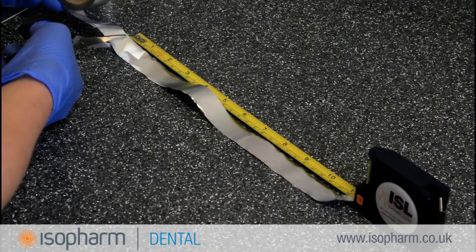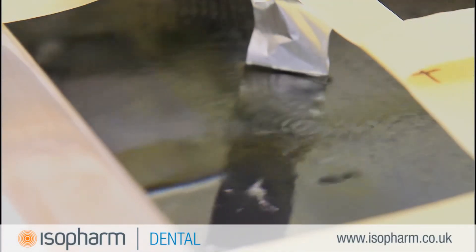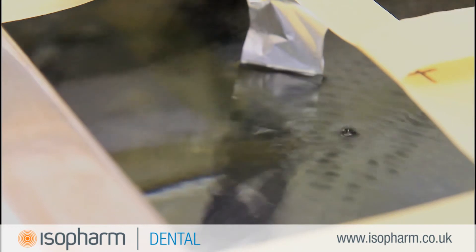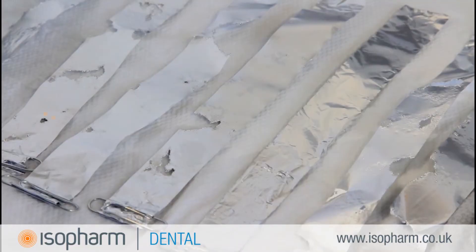Strips of foil are used to monitor the ultrasonic activity in the tank of an ultrasonic cleaner. This is achieved by suspending strips of foil in the tank and running a cycle. The ultrasonic activity will erode the foil edges and prove that the transducers beneath the tank are operating effectively.